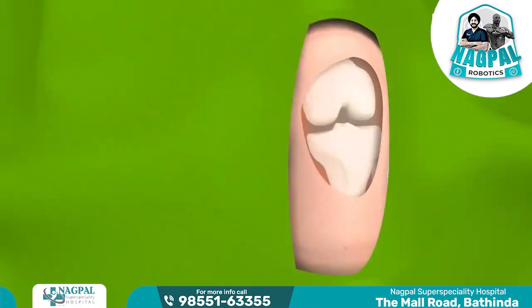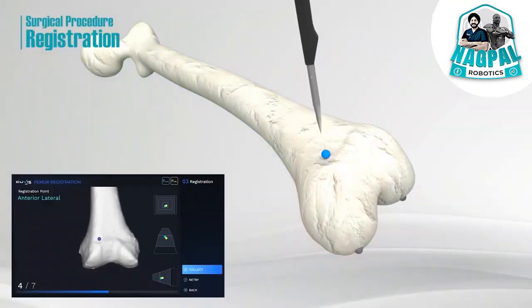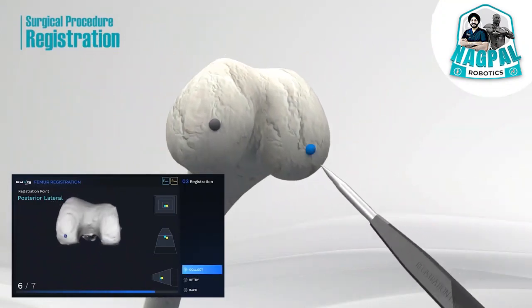Once it is done, the user will proceed with the incision. Register the actual patient's data by clicking some points on specific surface areas of the femur and tibia. Follow the direction of the main console.